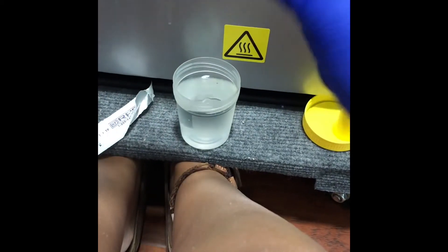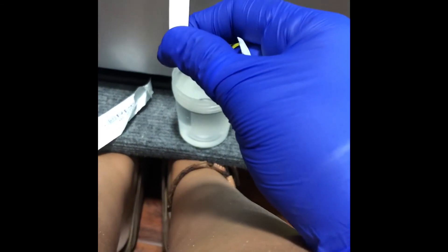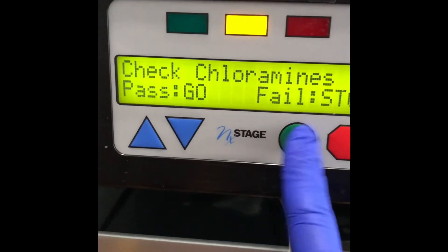When it's finished, if it's a good batch, it will be a bright yellow. This looks like it's pretty good. So I'll press the green button and it will ask me if it passed or failed.